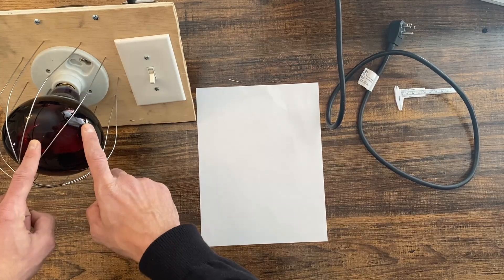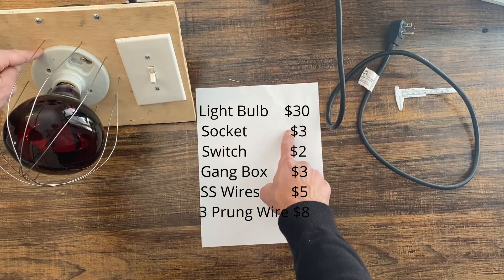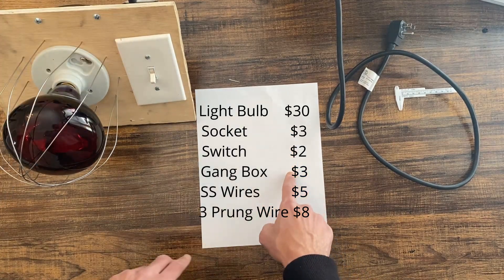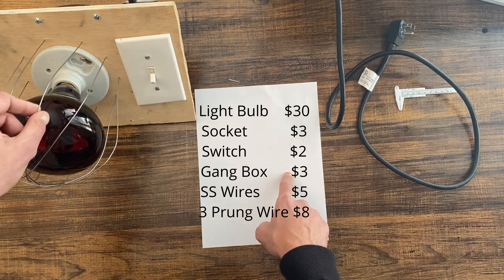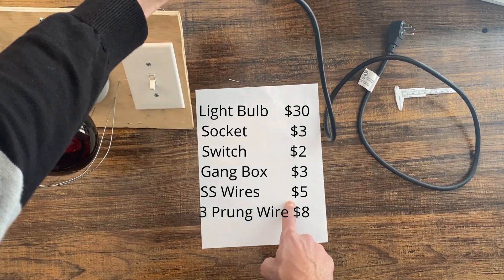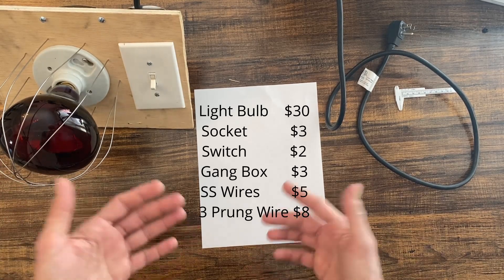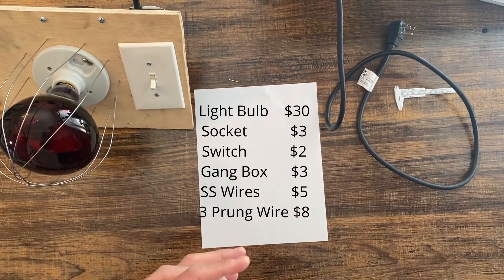In terms of cost: the light bulb was around $30, the socket about $3, the switch about $2, the electrical box about $3, the stainless steel shielding wires about $5, and the heavy-duty 3-prong cord about $8. Add them together and that's about 10% of what you'd pay for a professional device that costs over $500.